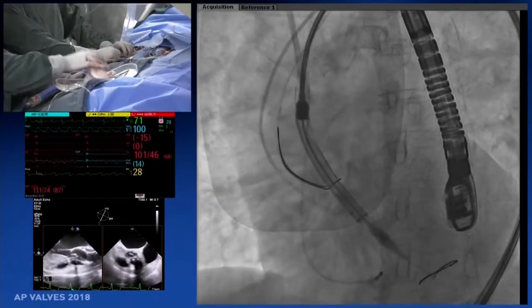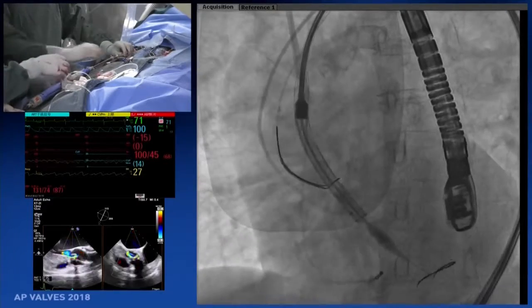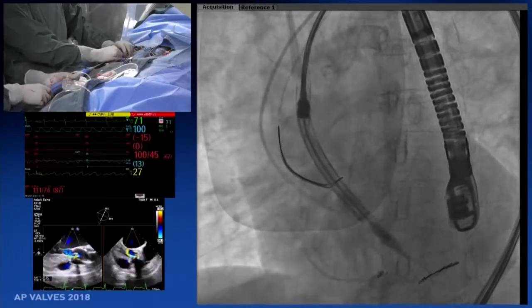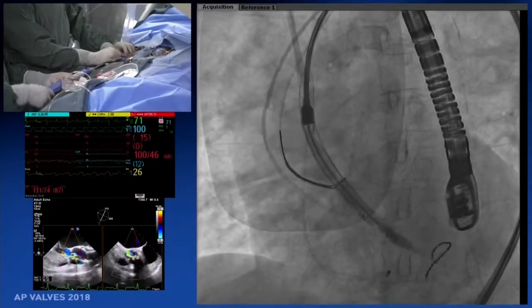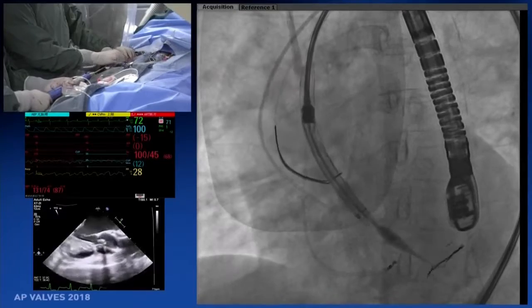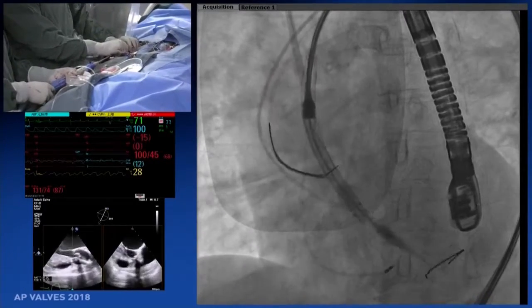I don't think it is a key to solve the problem. I think it's very tough because we are deploying now. It's too difficult. Just keep on going. The valve goes up now, and when you deploy it, it forces the valve into its horizontal position.